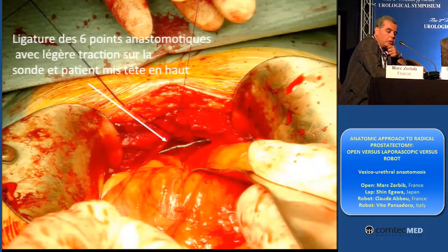And after I can have only to pull down my catheter and have a ligature with six stitches, which is completely — I tested it. It is dry. There is no leakage. And I am sure that securitization will be good.